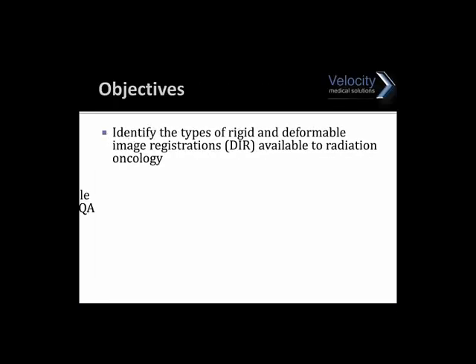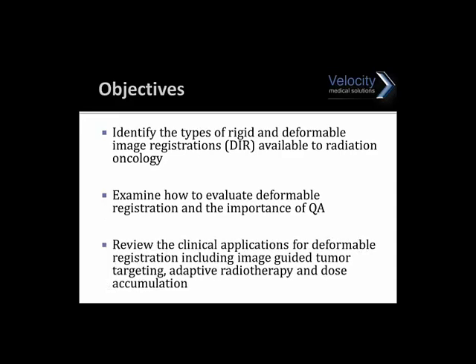Our aim here today with this webinar is to hopefully present educational information about deformable registration in radiation oncology. We have observed that image registration of any kind, whether it's rigid or deformable, is often required of dosimetry.